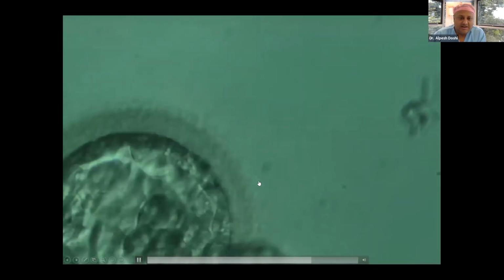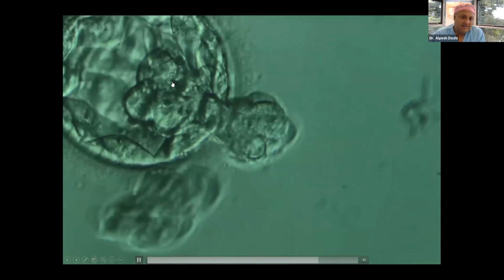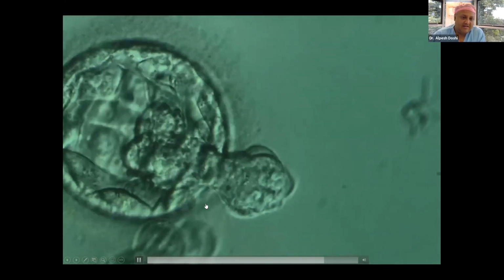And you'll see that when I apply the laser, there is a natural response of the cells dissociating from the remaining embryo. Here we go, and we've taken a nice small clump away from the embryo. Once we demagnify the picture there, you will see that there's a nice small clump. That is the remaining embryo, and there's a small nice clump that is going to be seen just in a second. So here we are, that's the embryo itself, with the inner cell mass quite intact.